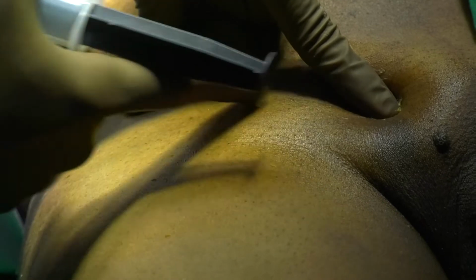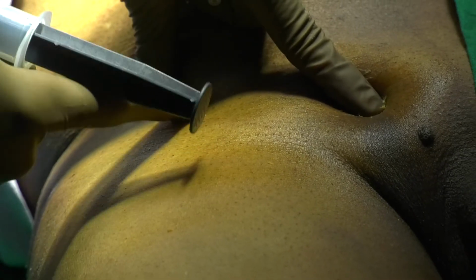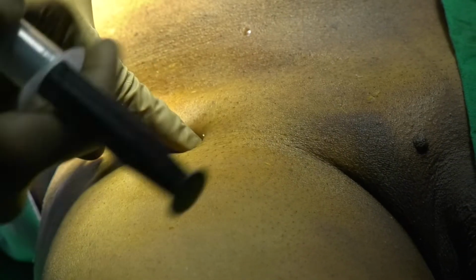This is the anterior superior iliac spine. This is the pubic tubercle. Can you see? This is medial 2/3, lateral 1/3. I will go 2 to 2.5 centimeters below that.